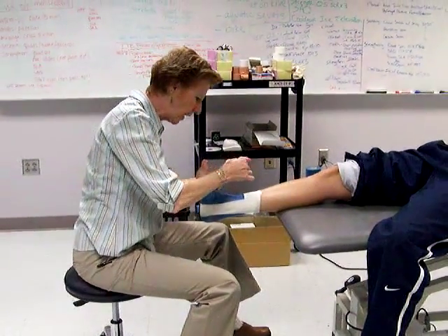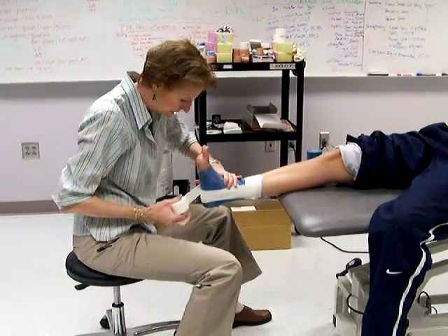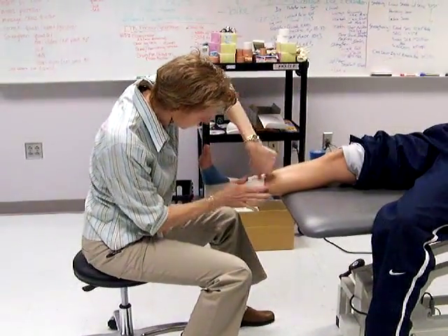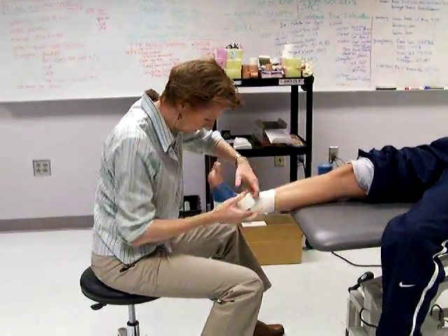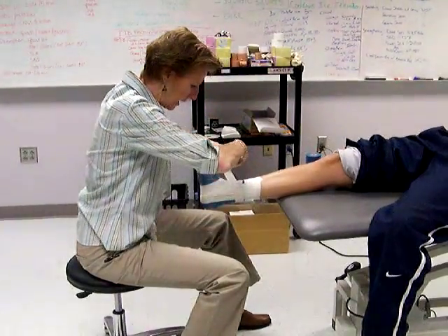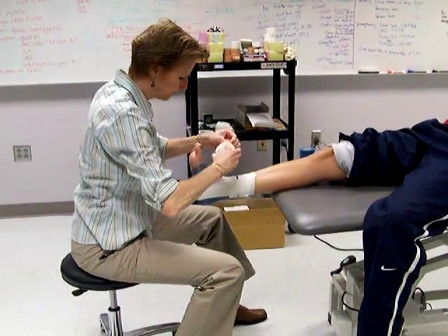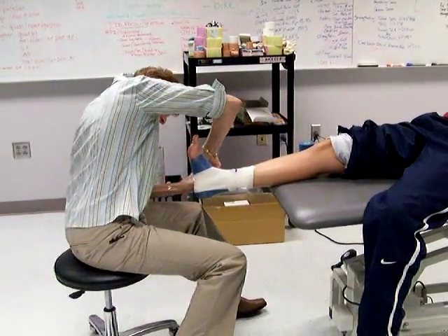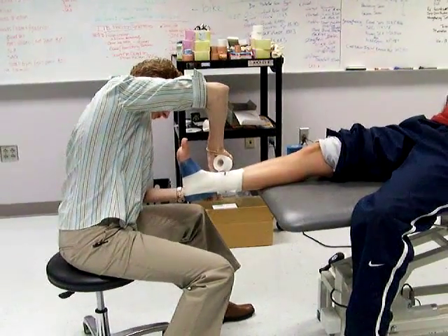Then you start doing figure eights. Figure eights usually come across the dome of the talus. You can do half of one or a full one. Watch your angles — don't fight your tape, don't let it wrinkle. You keep coming around and back across, and you can do this both medially and laterally. Go the other way across the front of the ankle and around — follow your tape. Figure eights crisscross the front of the ankle.